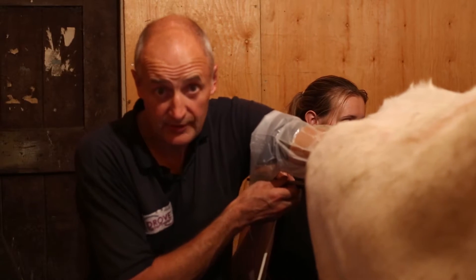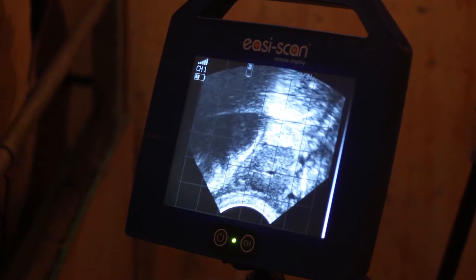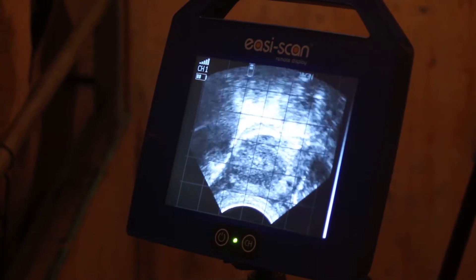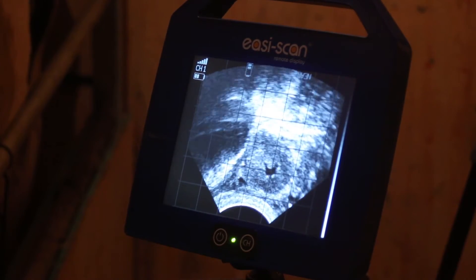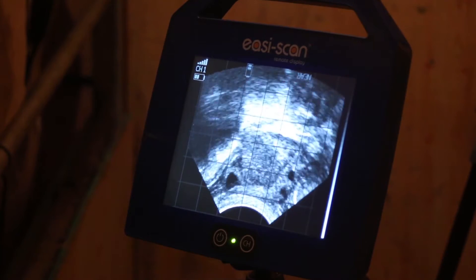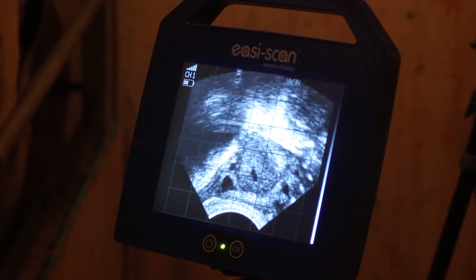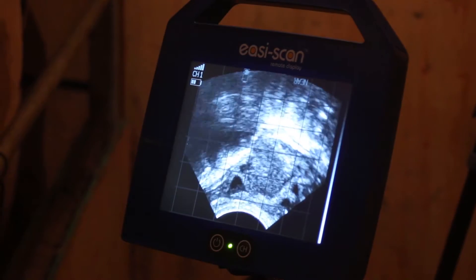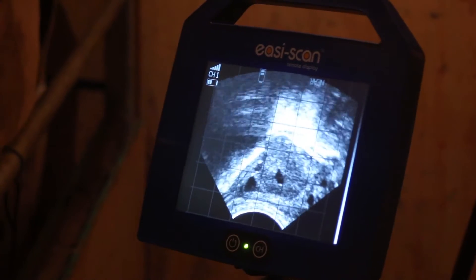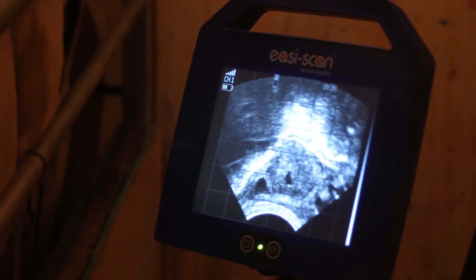I'm now going to move the ovary around a little bit and start getting some of the smaller follicles. Hopefully we'll be able to see that on the screen later as well. There's a grid on the screen and one of the lines on the grid is exactly where the needle emerges, so that gives me a good starting point to know exactly where to aim. I'm gently rotating the ovary around, moving around the surface and picking off all the little follicles around the circumference.